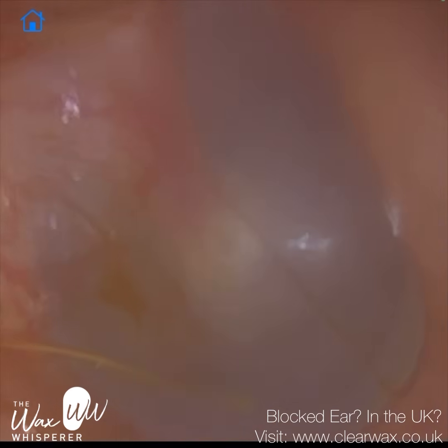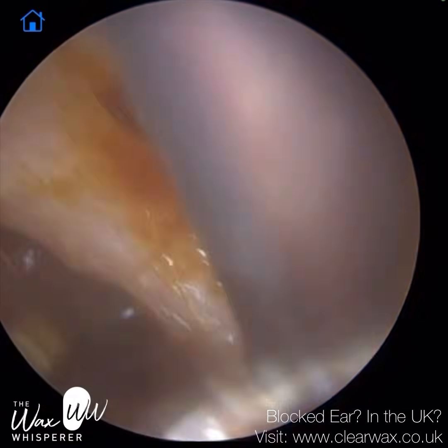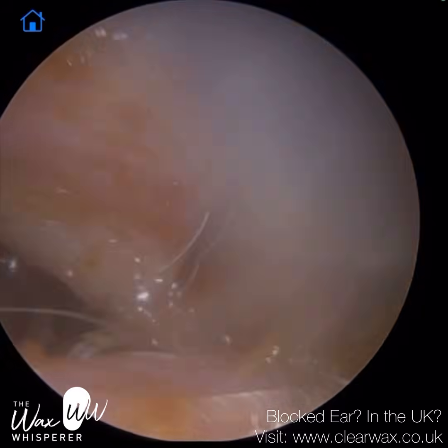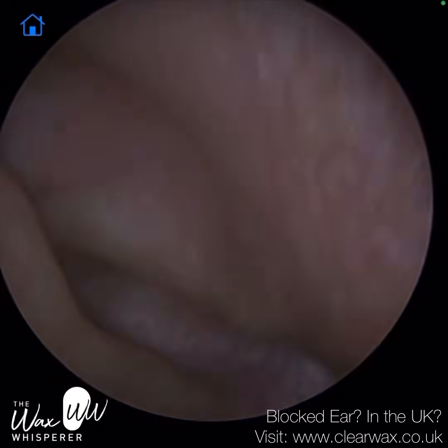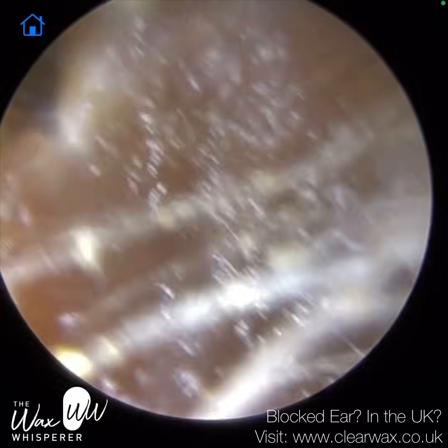That's the patient's eardrum. So it's nice and visible. It's just a bit of soft wax just at the entrance. We're just going to mop this away. They have got quite a narrow entrance, which is possibly another reason why this patient's getting a wax impaction. The wax can't naturally migrate.